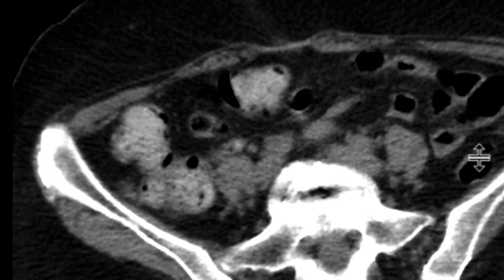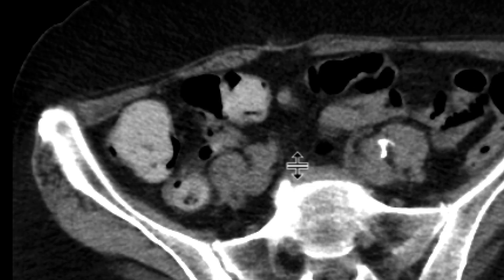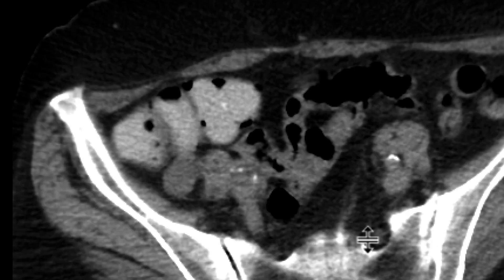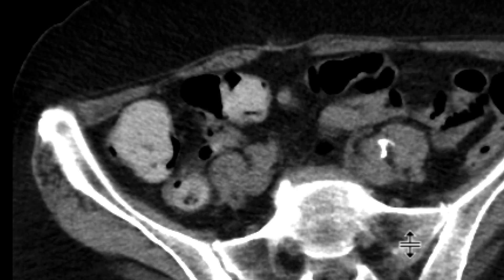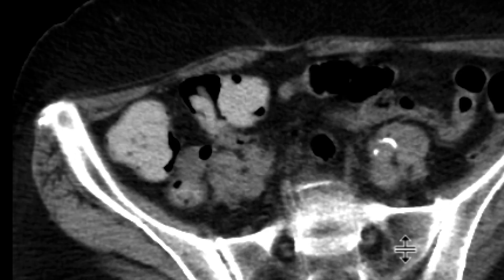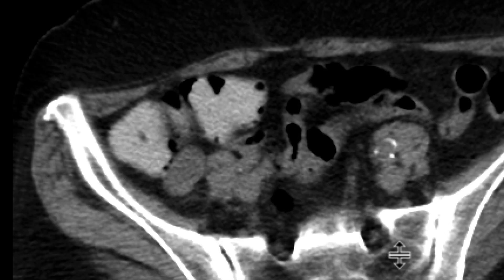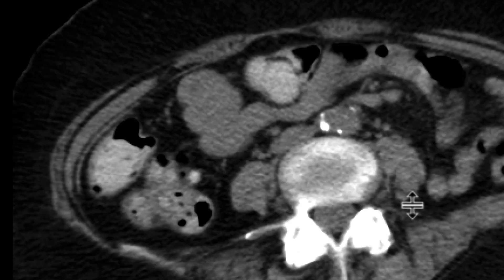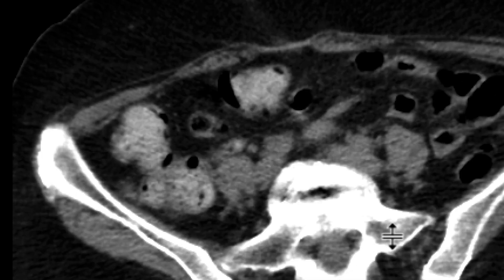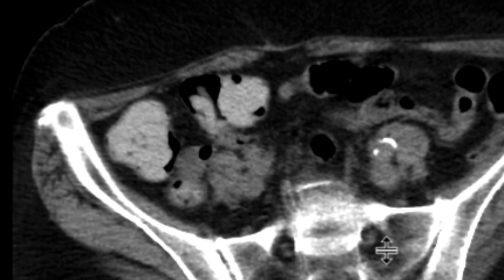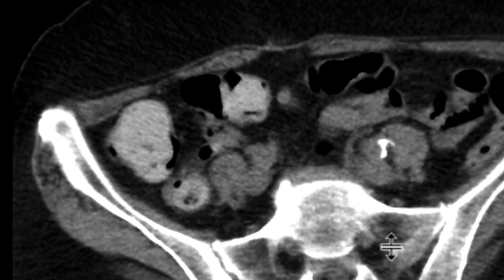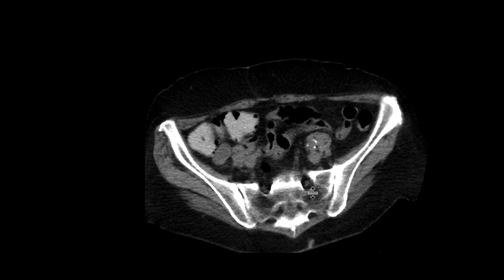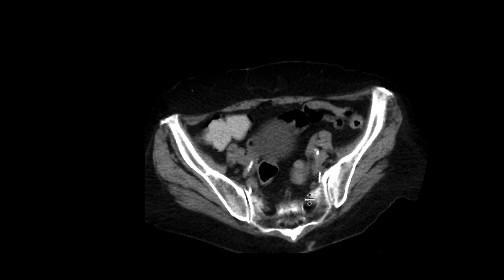You can see it over there, and as we follow that, it curls back on itself and leads to this area here that's blind ending and fluid filled. That tip of the appendix is just expanded and fluid filled like that. That itself is suspicious for a mucocele. Mucoceles can be due to a number of causes, and this does require resection. This was resected, and it turned out to be a low-grade appendiceal mucinous neoplasm.